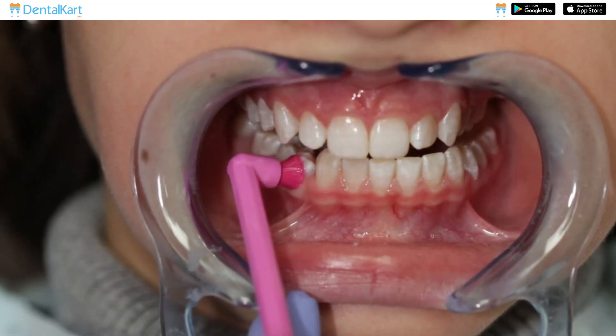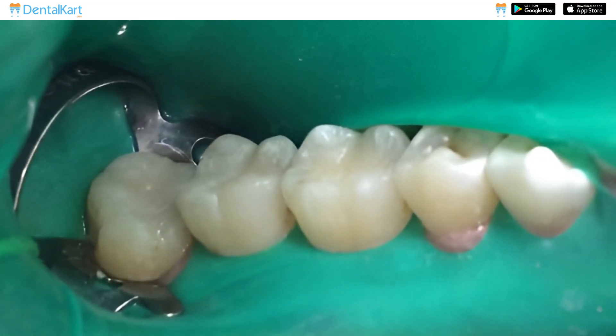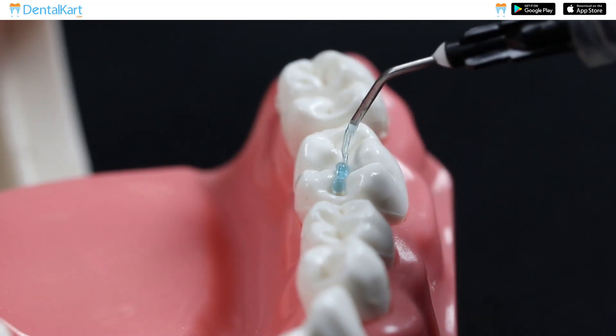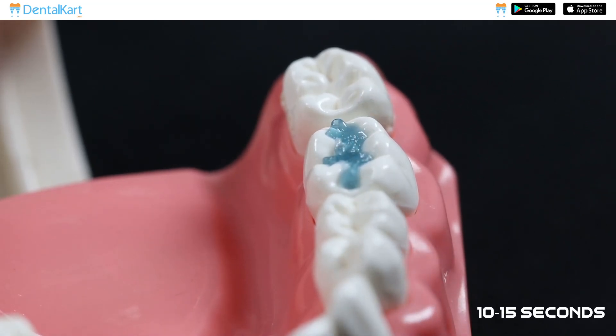Prepare the tooth surface by cleaning it thoroughly and drying it. Isolate the tooth using a dental dam or cotton rolls to maintain a dry working environment. Etch the occlusal surface with a gentle phosphoric acid etchant for at least 10-15 seconds.